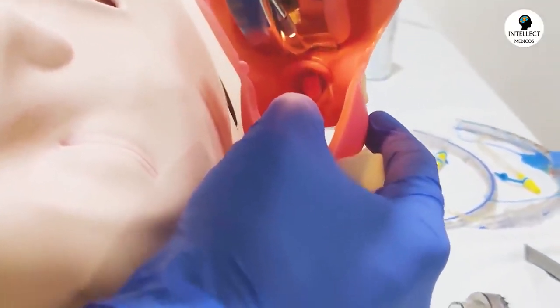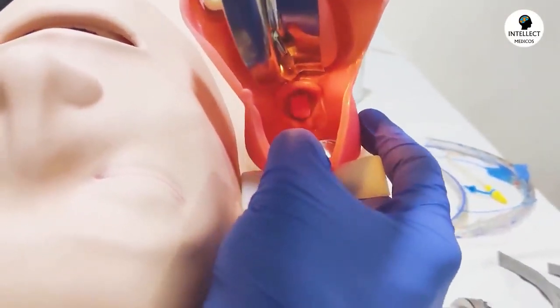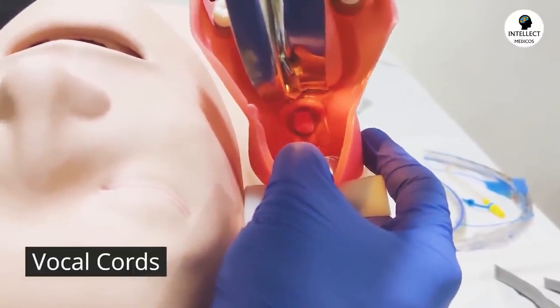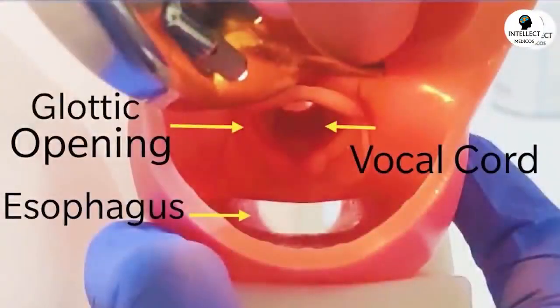So that V-shaped structure is the vocal cord, and you can see the glottic opening. Can you see it? Anteriorly is the glottic opening, and this V shape which you can see are the arytenoids. In between are the vocal cords, and posteriorly you can see the esophageal opening.